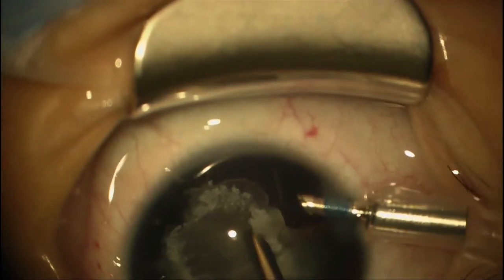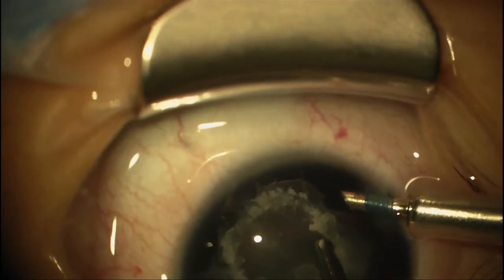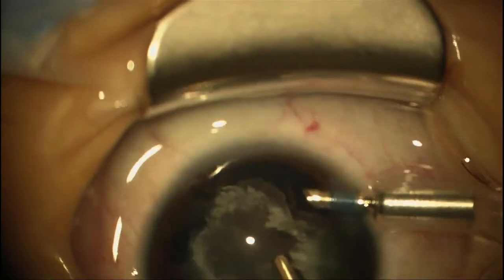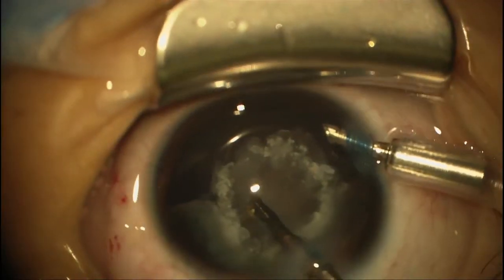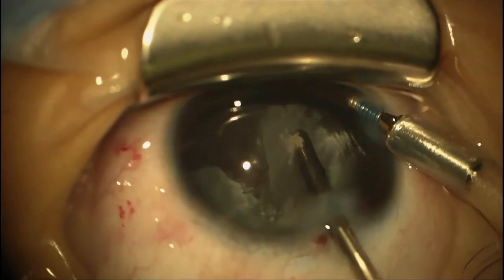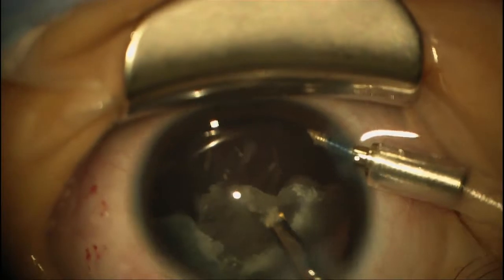Someone is asking what kind of cataract this is — nuclear, posterior polar, zonular? It's just kind of a combined cataract. Most of the opacification is in the cortex, just outside the nucleus. You can see these funny opaque areas — they're like little specks, like little rocks.